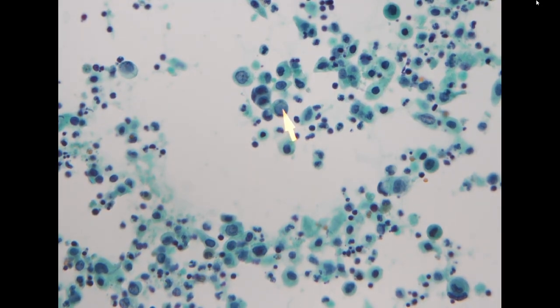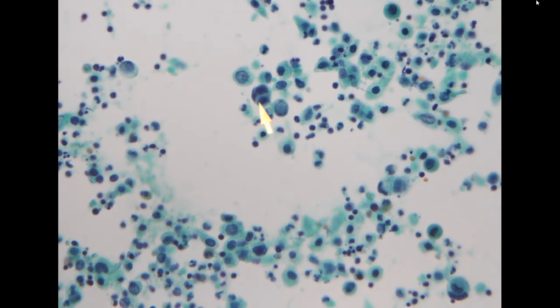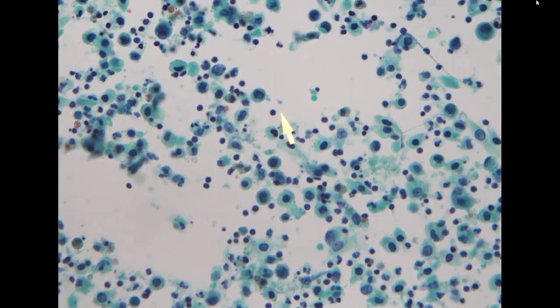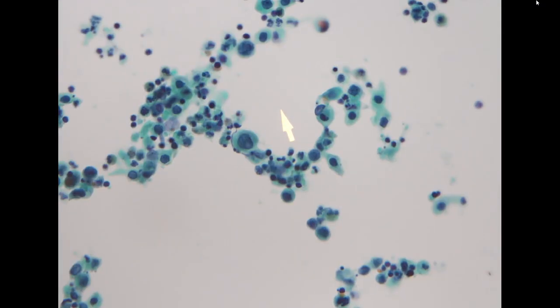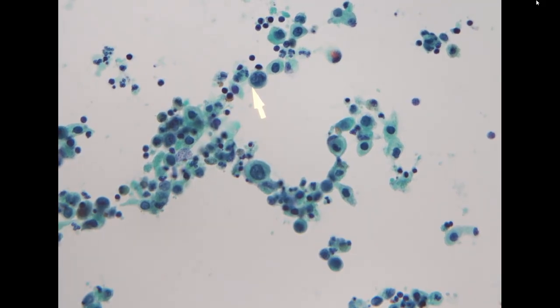So in this specimen, we didn't see the typical adenocarcinoma feature that we see in the other specimen. Instead, we see much smaller cells, higher NC ratio, some with much more coarse chromatin, hyperchromasia. It is a little bit difficult to make a judgment of the differentiation. So here we just call it carcinoma.